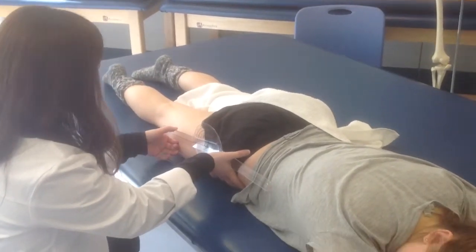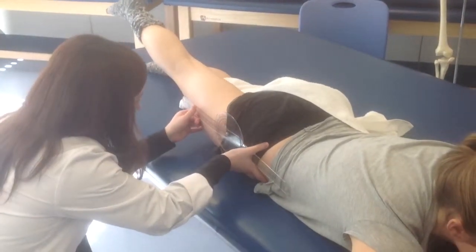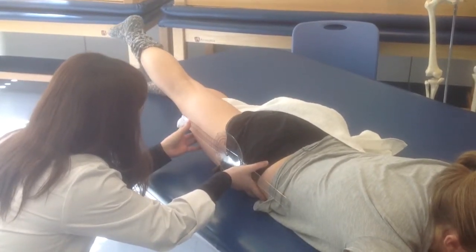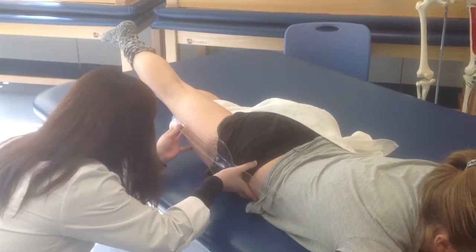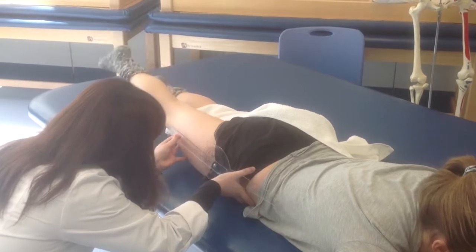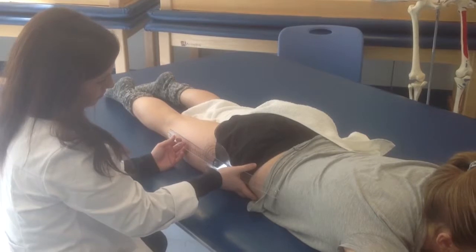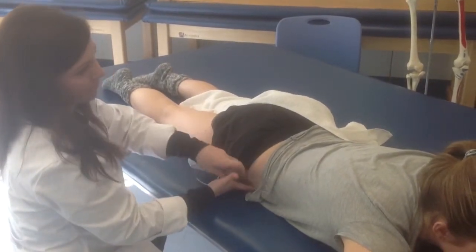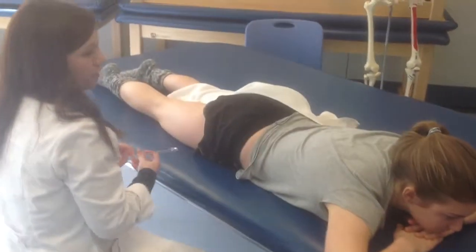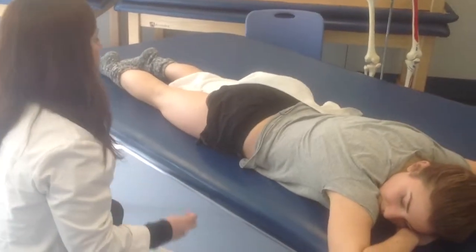Ms. Corbin, can I have you raise your leg toward the ceiling without bending your knee? Extend the hip by raising the lower extremity from the table. Maintain the knee in extension throughout the movement to ensure that tension in the two-joint rectus femoris muscle does not limit the hip extension range of motion. And relax. The end of the range of motion occurs when resistance to further motion of the femur is felt and attempts at overcoming the resistance cause anterior tilting of the pelvis and/or extension of the lumbar spine. Without letting her pelvis rotate, I measured her active range of motion at 0 to 6 degrees of extension.